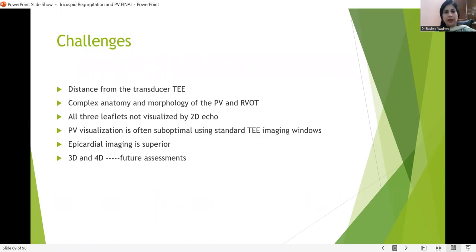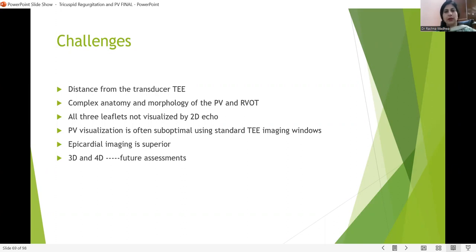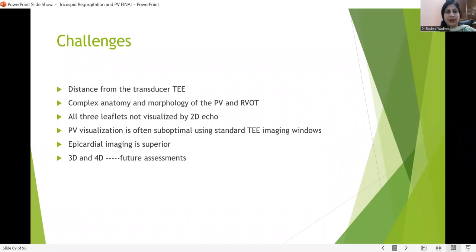Pulmonary valve echocardiography is challenging because the probe is in the esophagus and the pulmonary valve is the anteriormost structure — the distance from the transducer may be a problem. The complex anatomy and morphology of the pulmonary valve and RVOT add further challenges, and we cannot see all 3D leaflet features by 2D echo alone. Transthoracic imaging is actually a better way of assessing the pulmonary valve, just because it is the anteriormost structure and the probe is placed anteriorly on the chest.